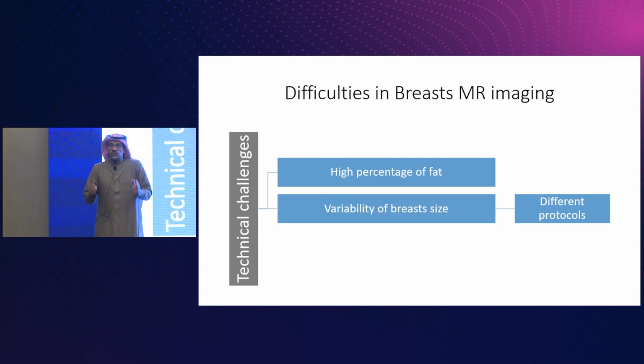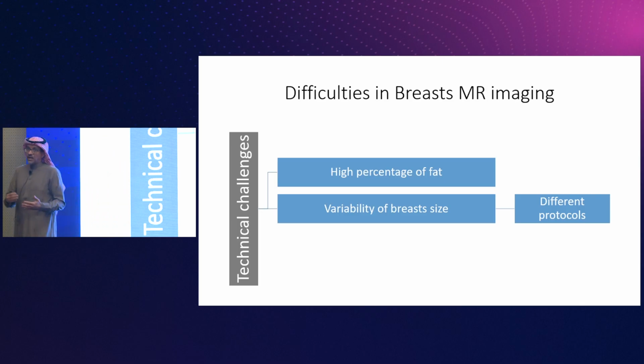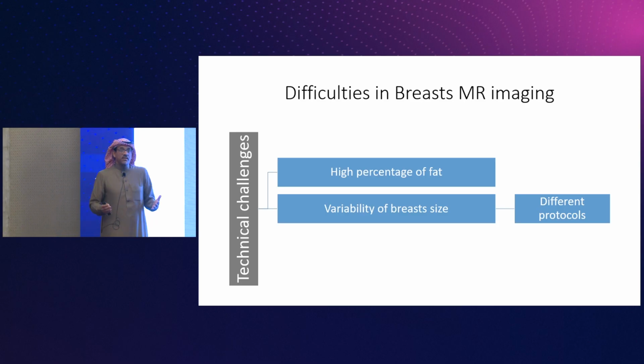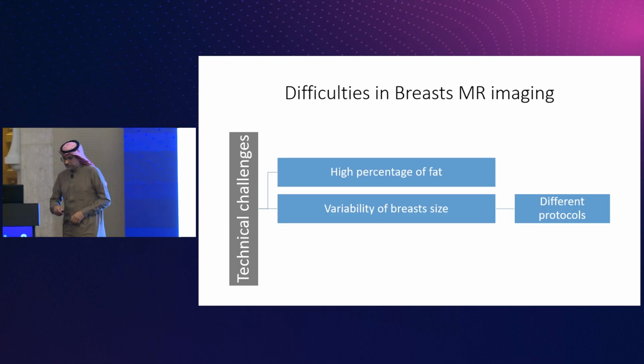It is set for you. Because too many changes in the practice will lead to an error. So we made it ready. Even if you have a new tech who just joined the team and starts to do this exam, he will not change from one to another. He just needs to have it and apply it. So we have this technique.